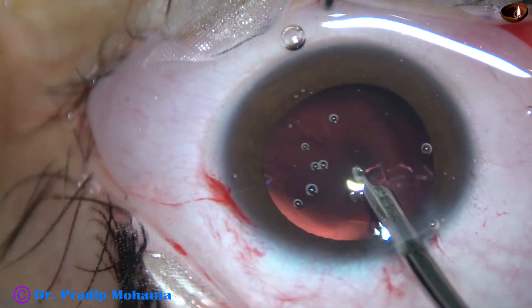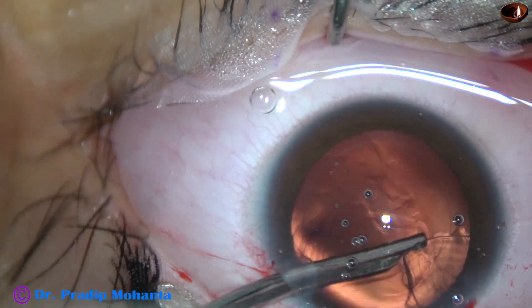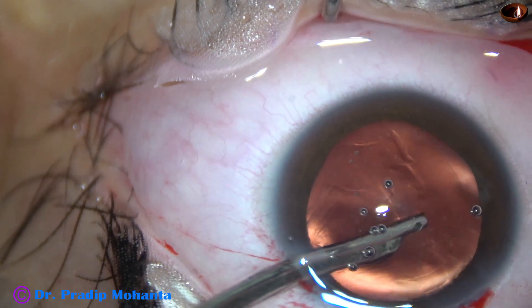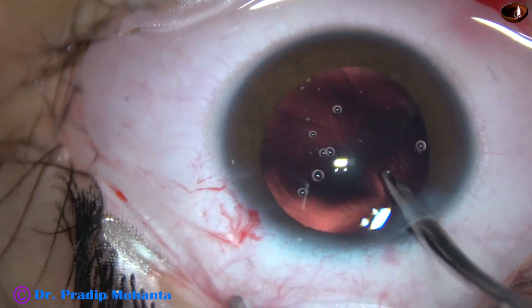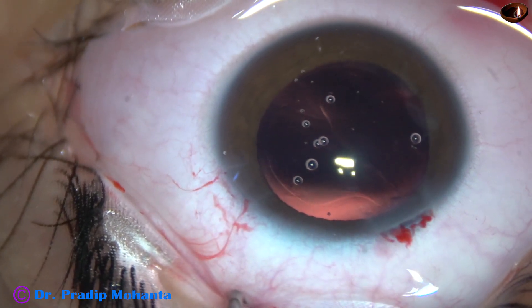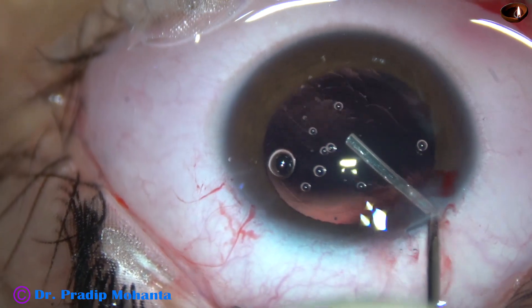We have selected a multi-piece intraocular lens because the haptics support the equator of the capsular bag better. The haptics of multi-piece intraocular lenses support the equator of the capsular bag in a much better way than single-piece intraocular lenses.